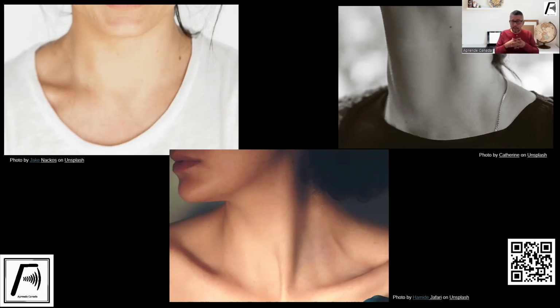In my experience, usually, asking the patient to turn the head a little bit takes care of things. I don't have to keep asking the patient to go back and forth. So it's not that it's going to be annoying to the patient. The other thing, of course, to do is you can slide the transducer away from that area. But as you know, sometimes that's not possible, because the neck is a small window, right? So we can only do so much.